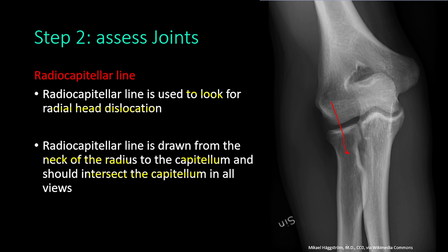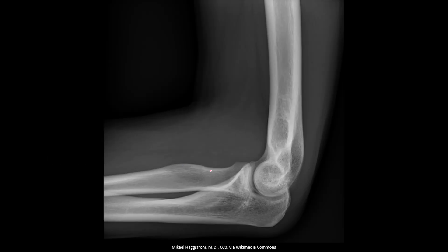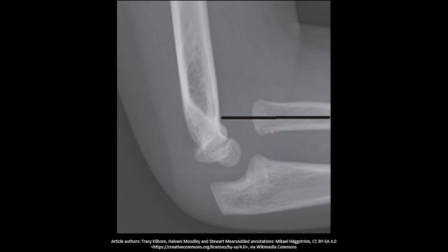An important note is that the radio-capitellar line is drawn from the radial neck and not from the radial shaft, because the radial neck is angulated relative to the radial shaft. On the lateral x-ray, we draw from the radial neck toward the capitellum, and the line intersects the capitellum normally.